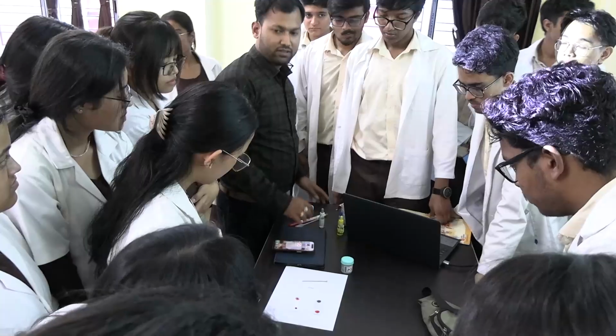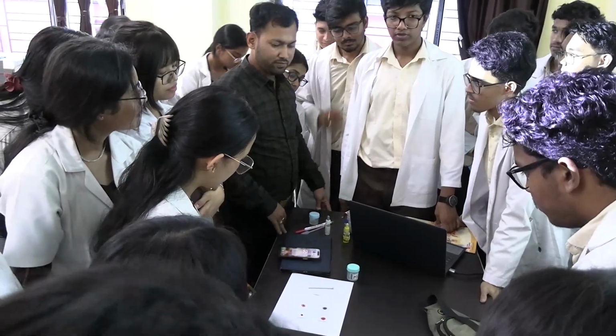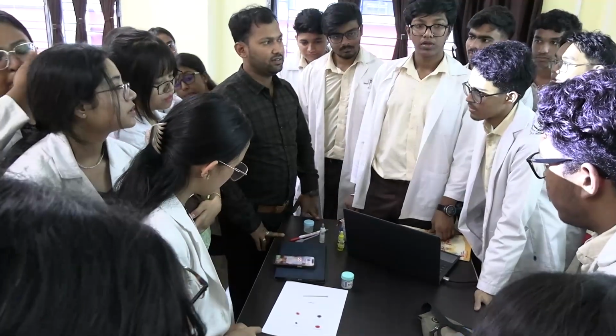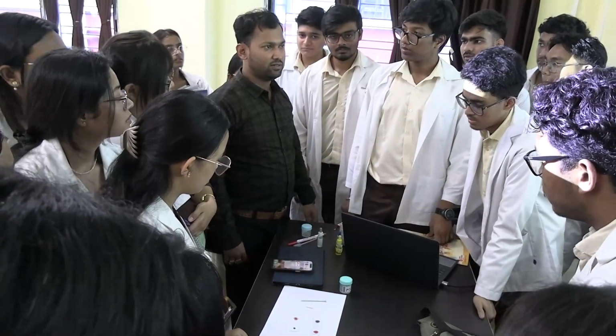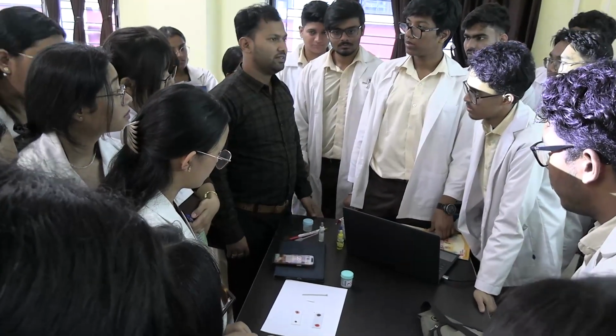So what is the group? How will you determine O? First of all, there is no clumping in A and B, so it is O. And if there is no clumping in the Rh test either, then it is negative.